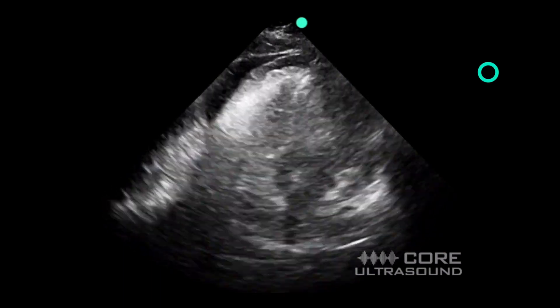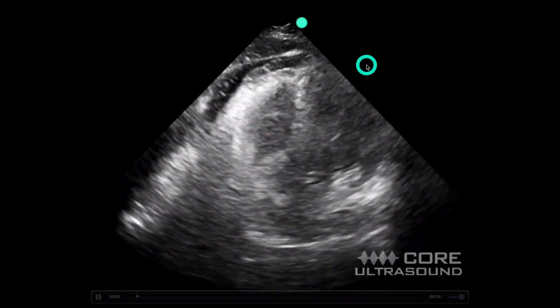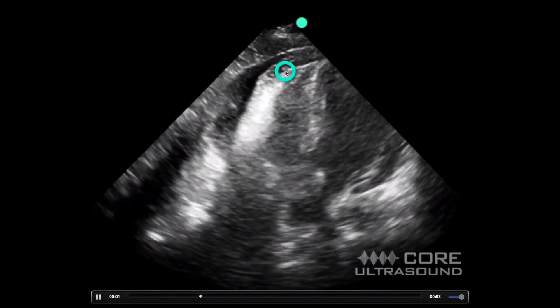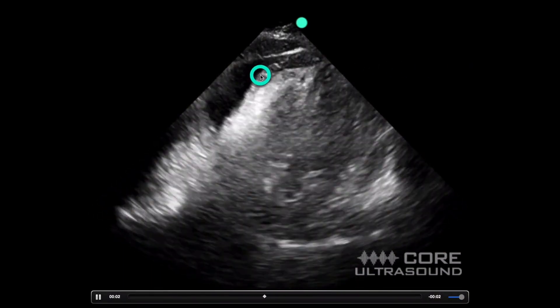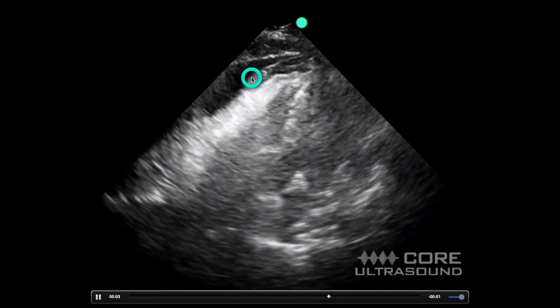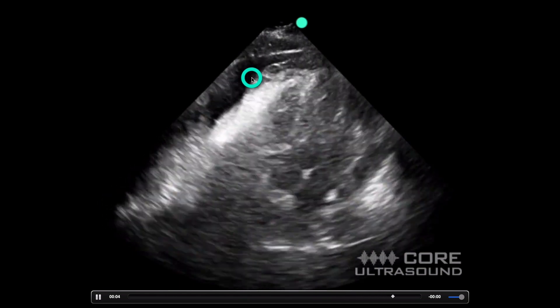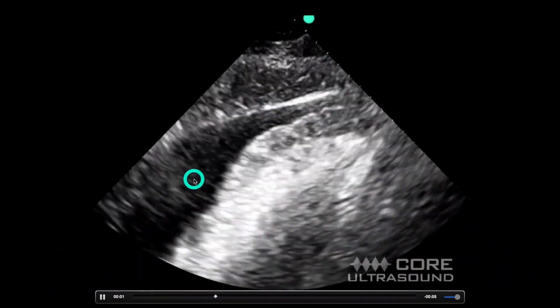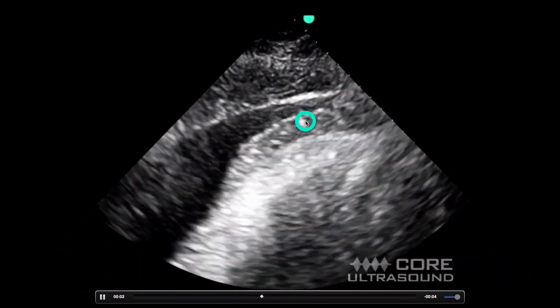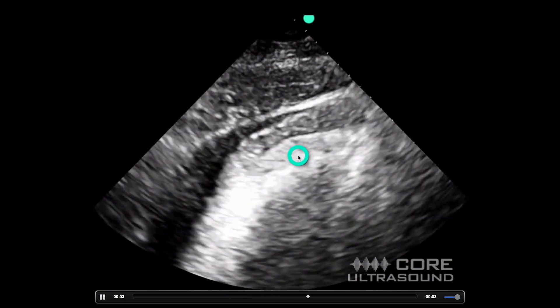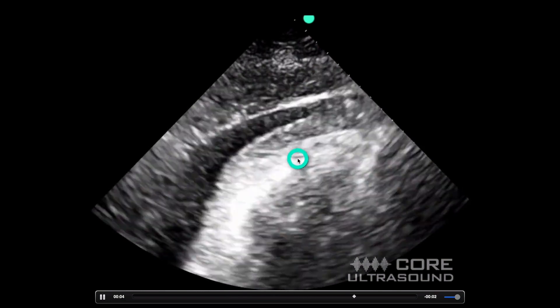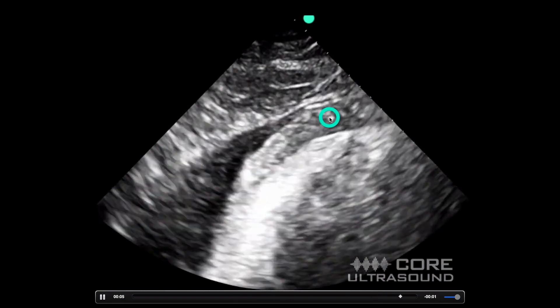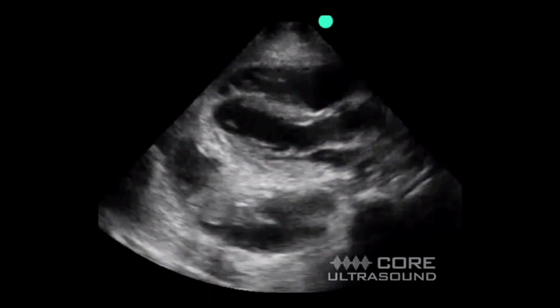Here is another view of a fat pad with an effusion — this is an apical four chamber view. If we zoom in, we can see that this is fluid, and this part is just stuck right onto that heart, making it a fat pad.